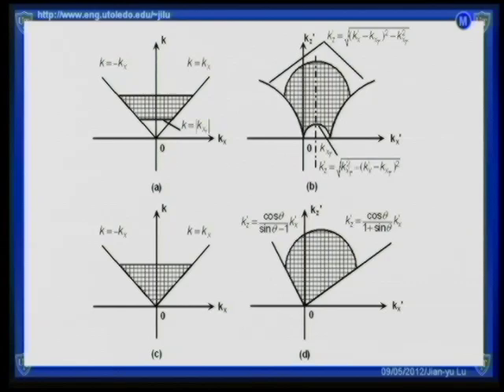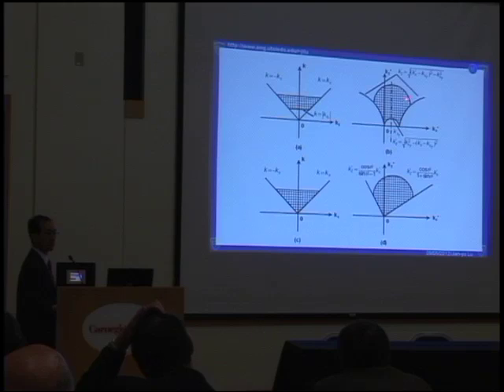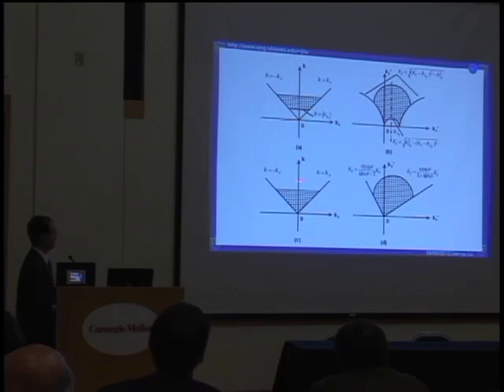This is the mapping we talked about in the Fourier space. Once we get the echo Fourier domain signals and do the Fourier transformation, it fills up the space in the Fourier space in this shape. And then you map it to the object Fourier domain, do inverse Fourier transformation, and you get images. That's with a limited diffraction array beam. But if you use a plane wave, then you get this area, and then you map it into the object Fourier domain and reconstruct the images.